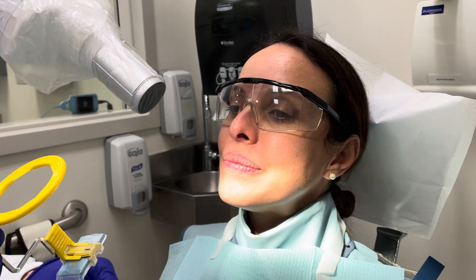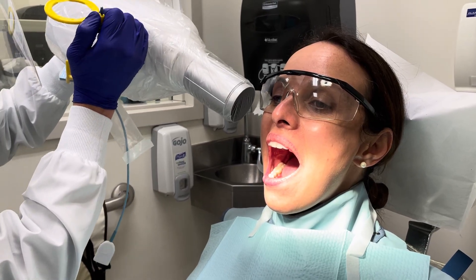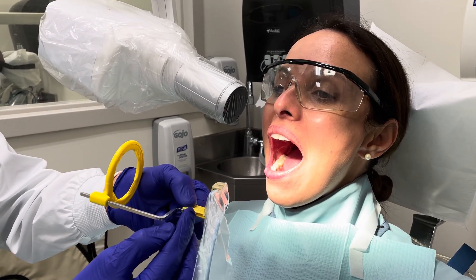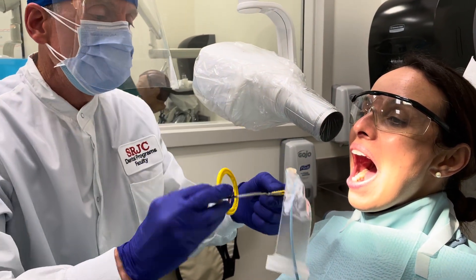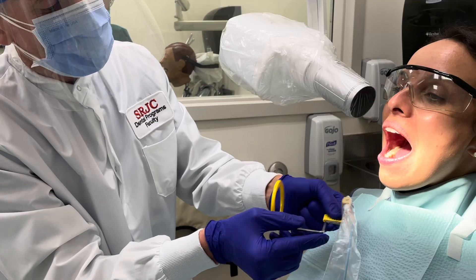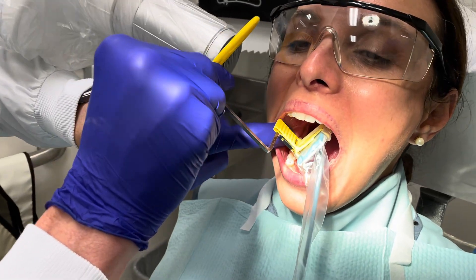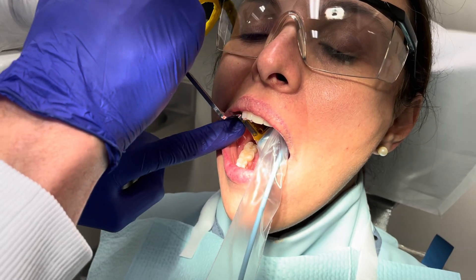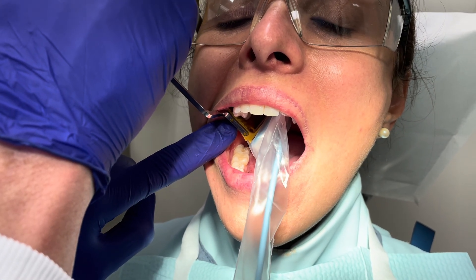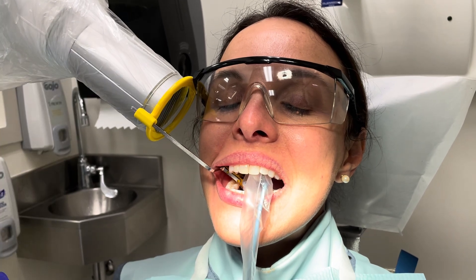Next one — molars. Same idea. We're going to get it way back there. This time, I'm going to try to show that we're getting far enough back so that the anterior portion of her first molar shows up in front of the bite block — that's the way I know I've got it far enough back. For these molar images, I like to bring the arm so that the commissure will fold and catch right there. Opening, deep in, inside the commissure, up against the teeth. So you can see the first portion of that premolar — it's a molar right there. Gently bite down. And there we go.